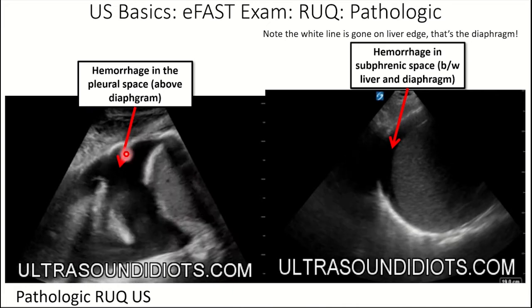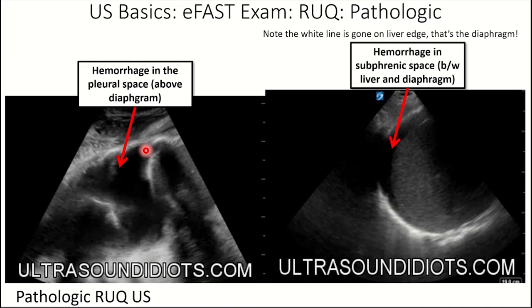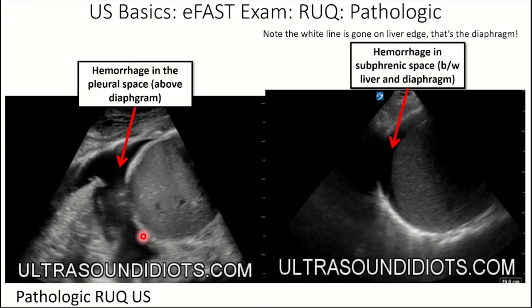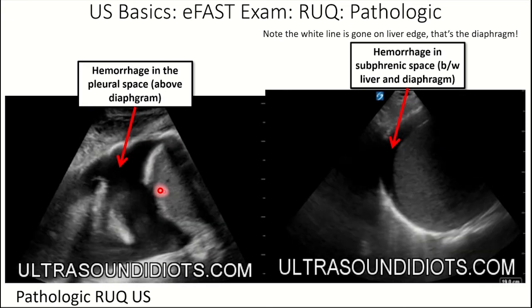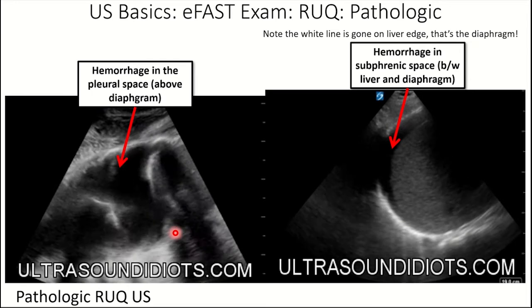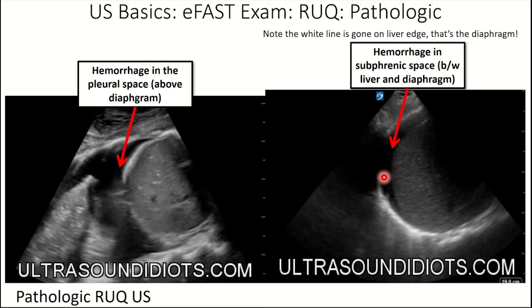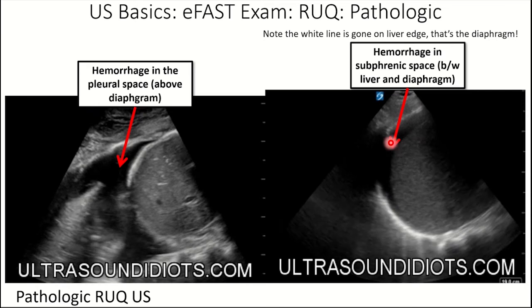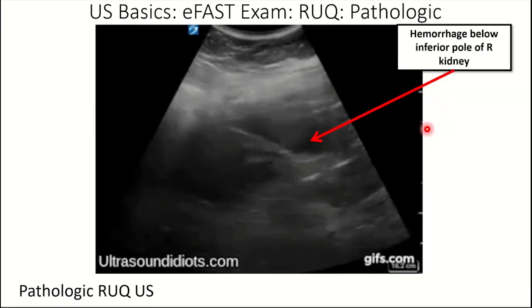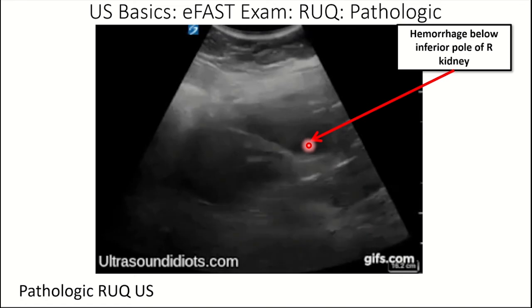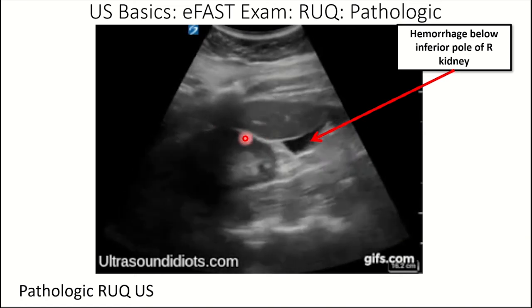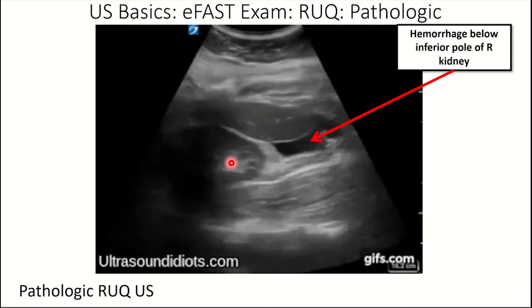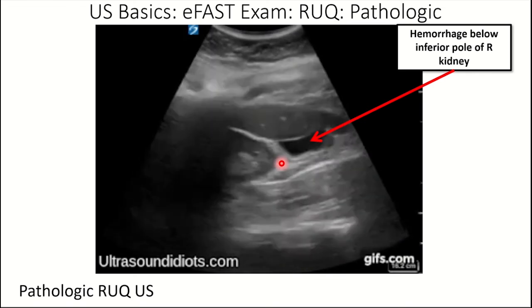Here's hemorrhage in the pleural space — we see black anechoic fluid between the lung and the diaphragmatic stripe, with the lung waving at us. We know it's in the pleural space because the diaphragmatic stripe is tugging tightly against the liver. On the other hand, here is hemorrhage in the subphrenic or subdiaphragmatic space — the diaphragmatic stripe is disconnected from the liver, with black anechoic fluid in between. Here's also hemorrhage at the inferior pole of the kidney — identified by the hypoechoic tissue with brighter white tissue in the middle representing the renal calyces.